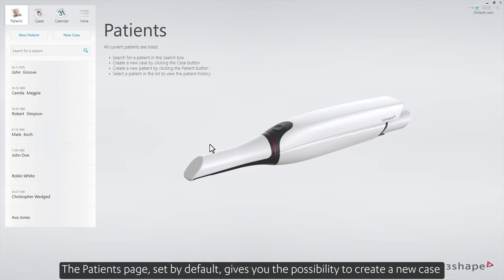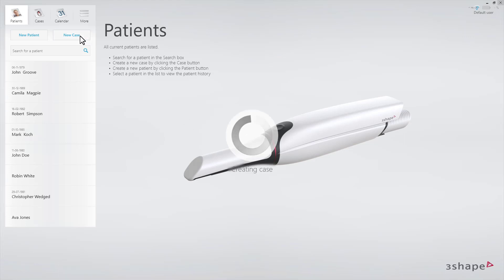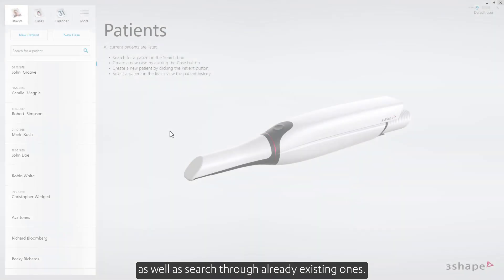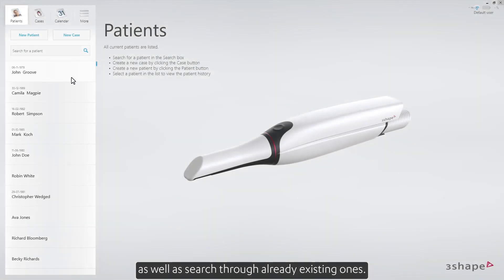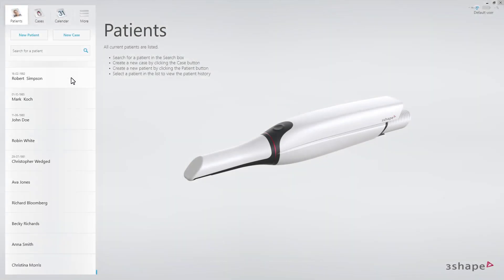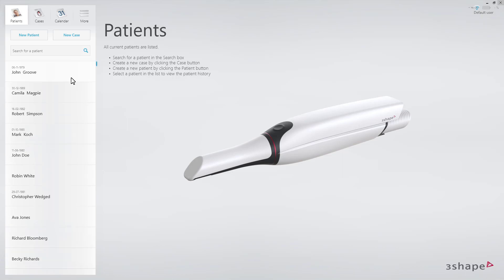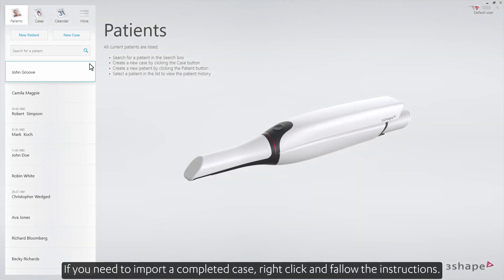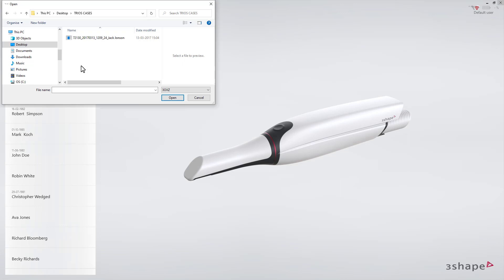The Patients page, set by default, gives you the possibility to create a new case, as well as search through already existing ones. If you need to import a completed case, right-click and follow the instructions.